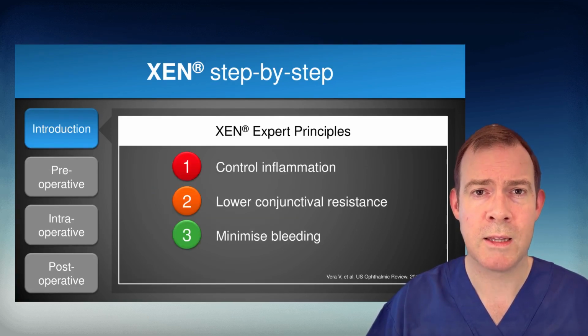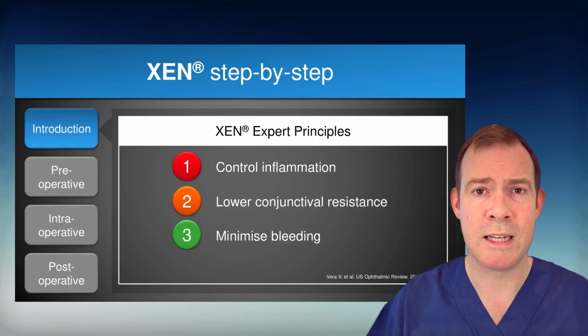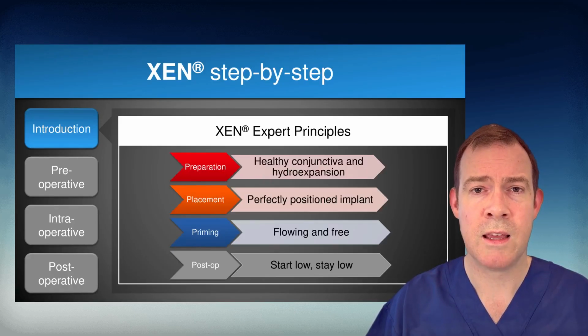There are 3 pillars: controlling inflammation, lowering conjunctival resistance, and minimizing bleeding. They can be remembered by the 4 Ps: preparation, placement, priming, and post-operative management. We're now going to look at a XEN surgery from start to finish, and then look at each of these principles in more detail.